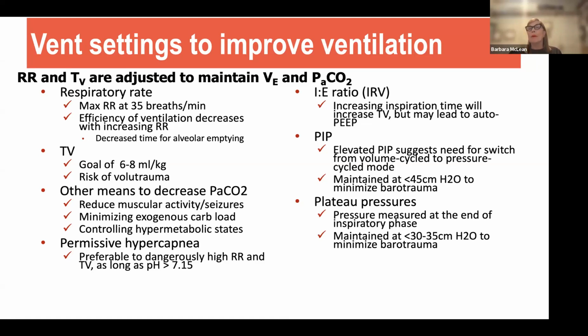I to E, very important. So when we talk about increasing inspiratory time, we're going to reduce the exhalation time. And so the proportional ratio, which normally for you and I is 1 to 4 for every breath we take, it's 1 part inspiration, 4 parts exhalation. It just depends on your respiratory cycle, how many seconds that is. But as we prolong inspiratory time, we're going to reduce the flow rate, deliver the gas into the lung much more slowly, but that can also lead to significant auto PEEP.